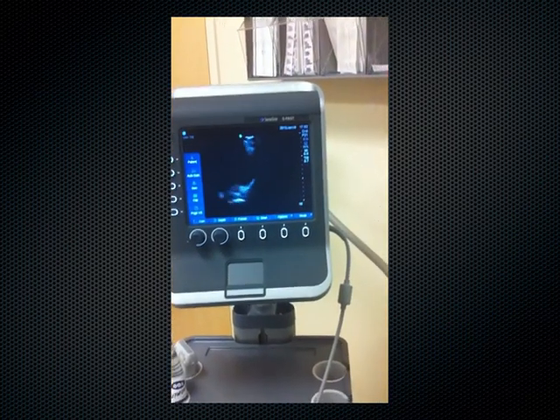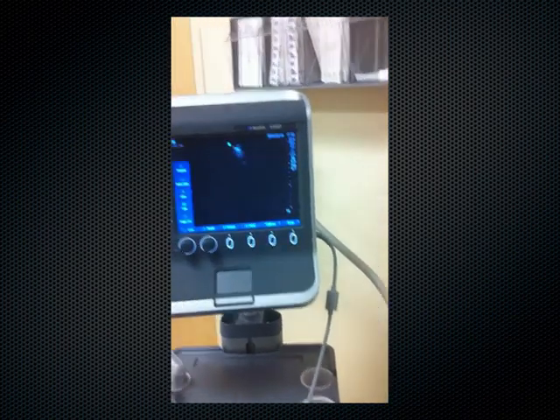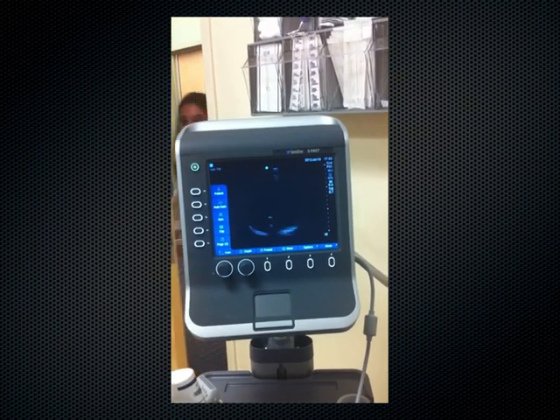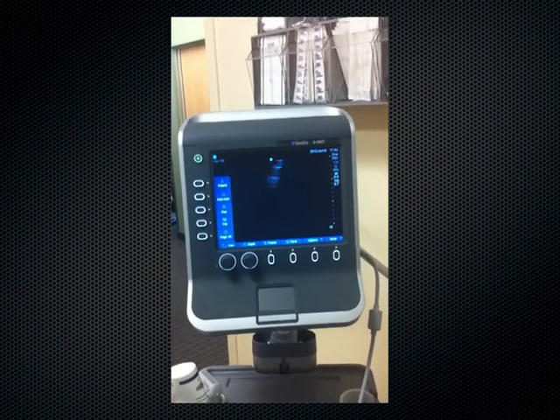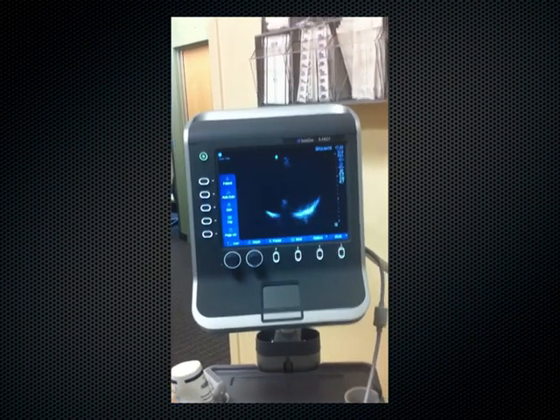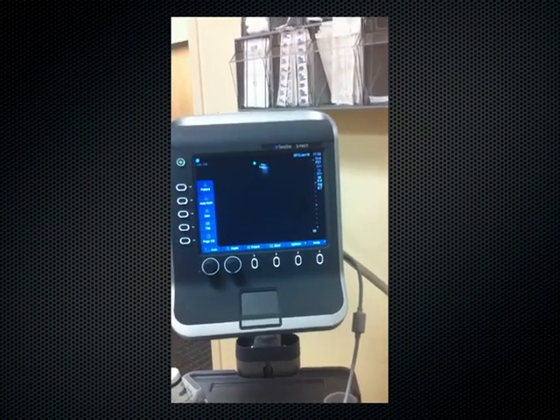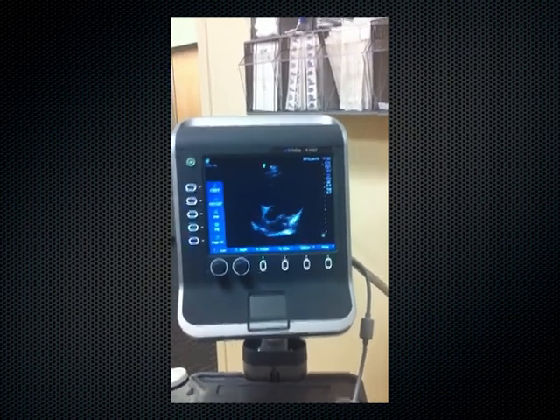I'm going to take off. Okay. No, I know you're outside. I had to listen in a little bit to make sure I wasn't on. So we had the patient, Kevin, where'd your heart go? We had the patient go left. It's still on there somewhere. So we could cut out that segment where we're trying to find it. There you go. That's good. There. Yeah, perfect. Okay. So now continue.